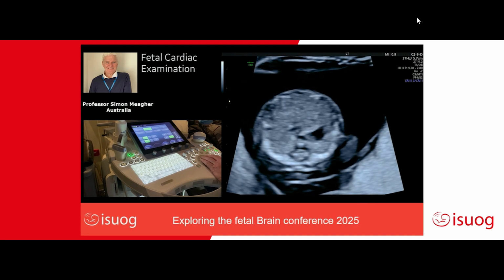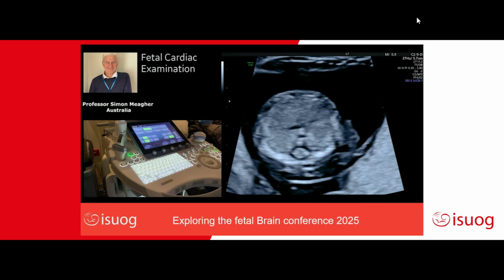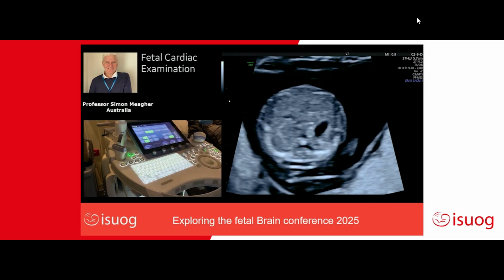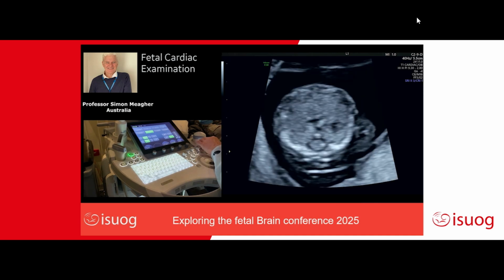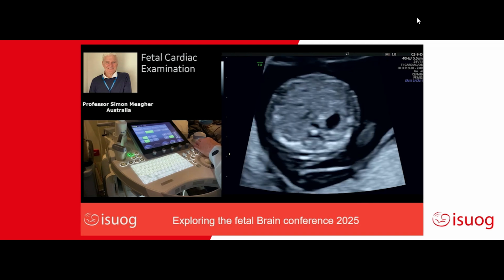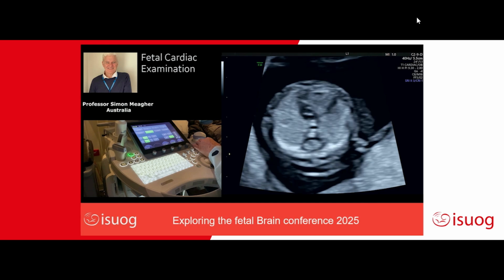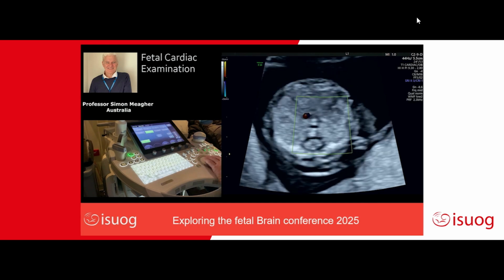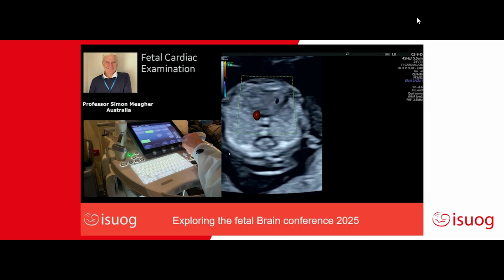But really the examination for me begins once I start using color Doppler. So for this, I'm going to go to the preset of cardiac, and then just go straight to HD zoom. The cardiac preset is mainly because of the color. It's ideal for all the color settings.